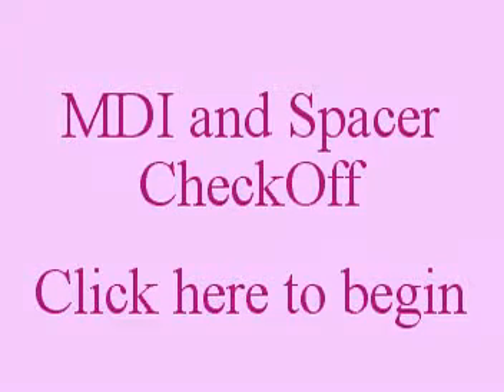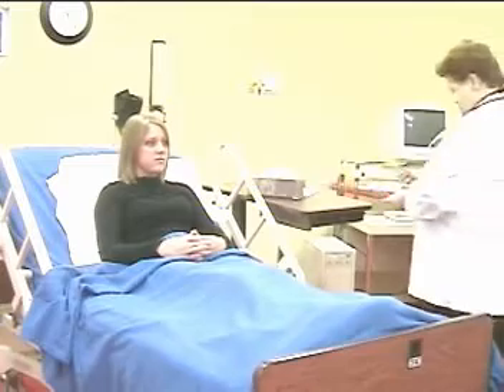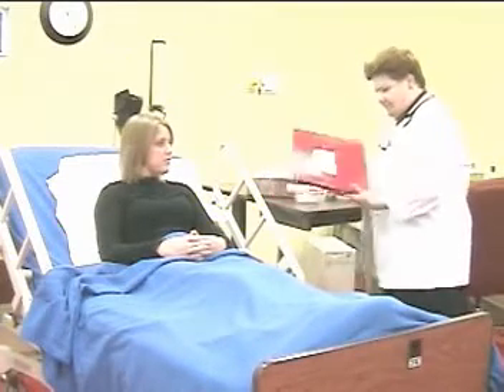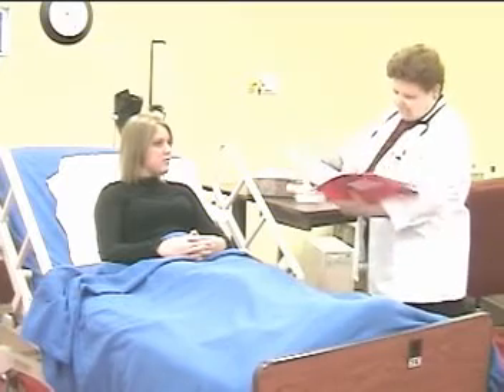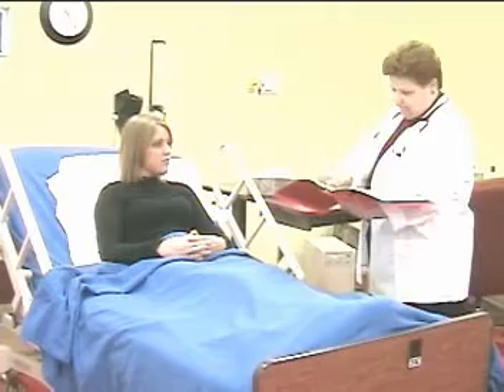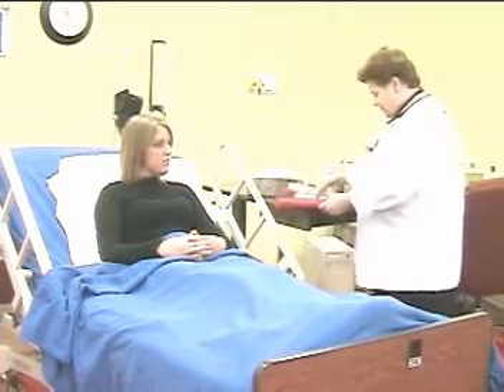MDI Administration Checkoff. Starts with verifying the physician order and reviewing the chart, then washes hands.